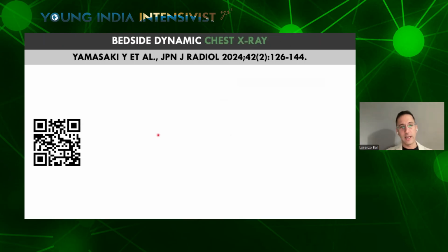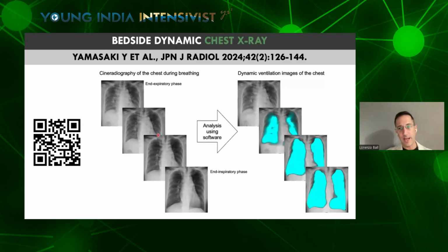There are evolving techniques at the bedside. We have algorithms that are being implemented in the machines we use to acquire chest X-rays. So we go back to where we started from. We can acquire a continuous chest X-ray during a breath hold. Any change that we see in the chest X-ray is probably due to the change of the blood content, so perfusion. Then I reacquire the same chest X-ray during dynamic ventilation, and changes in the chest X-ray in that case will be due to ventilation.